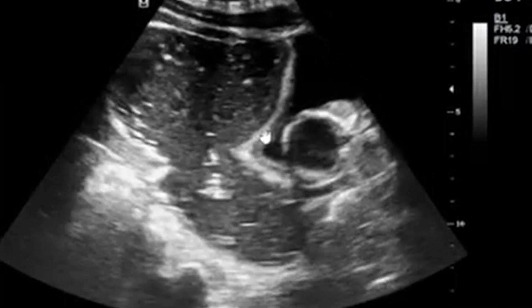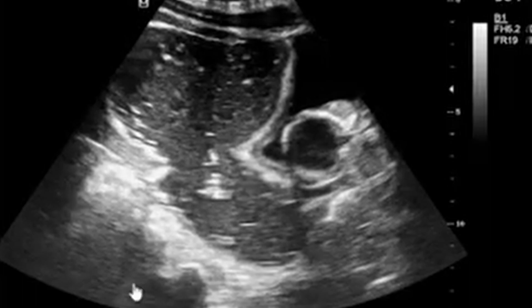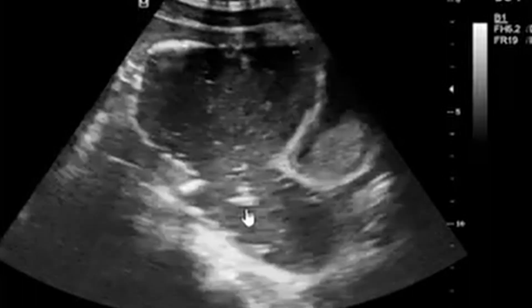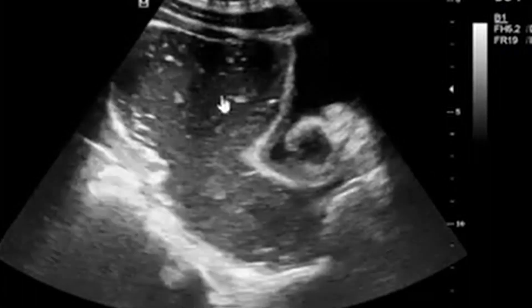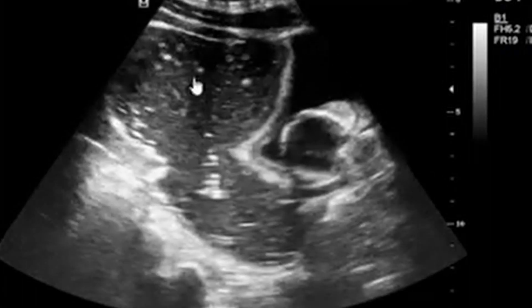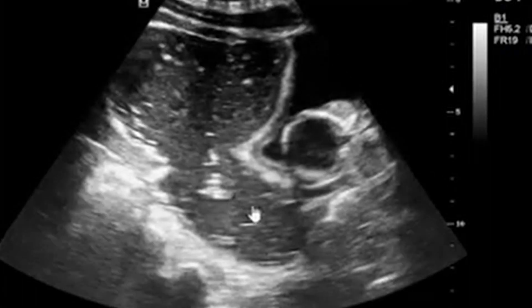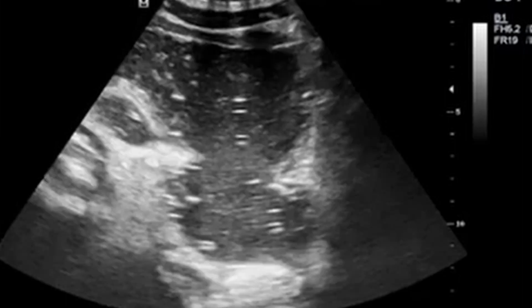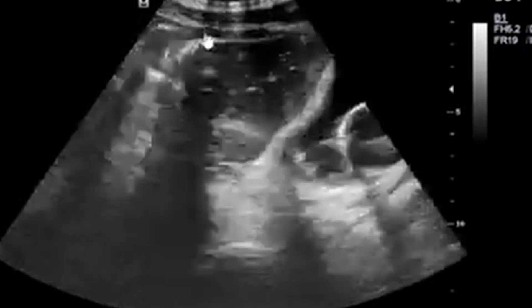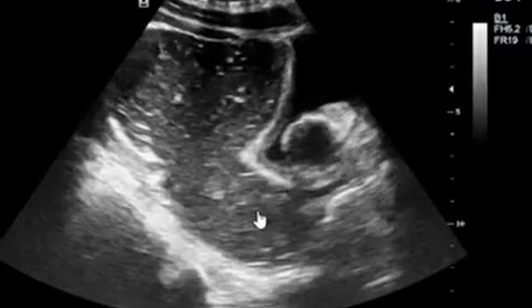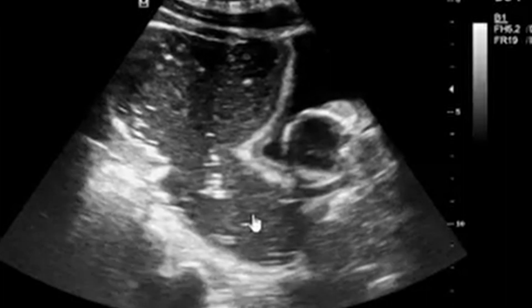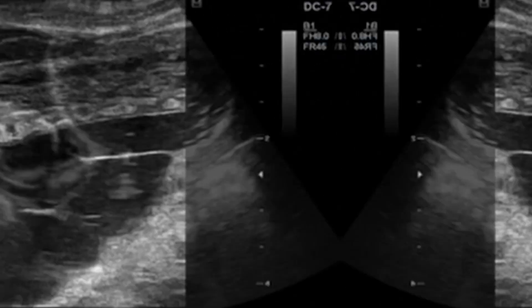This is a male patient who presented to the radiology department with diarrhea — a history of diarrhea for the past two days. You can appreciate what is taking place. This is diarrhea.